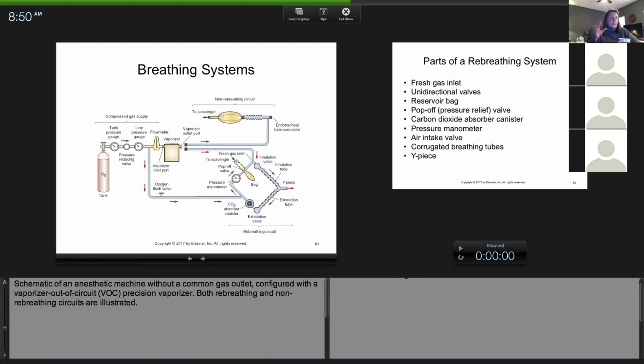Well, that's a good question, because on a schematic or when you're doing things in order, you could just put a little side note, like flush valve here. And as long as everybody understands that when you hit that, it won't go through the vaporizer. It's just going to be separate, outside. Yeah. Gotcha. That was my only question.